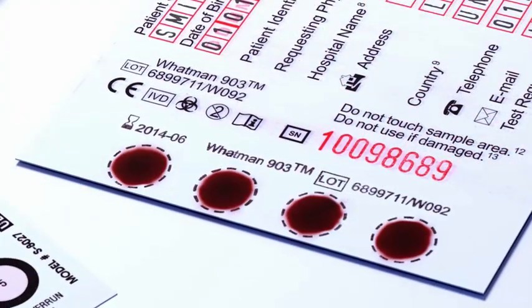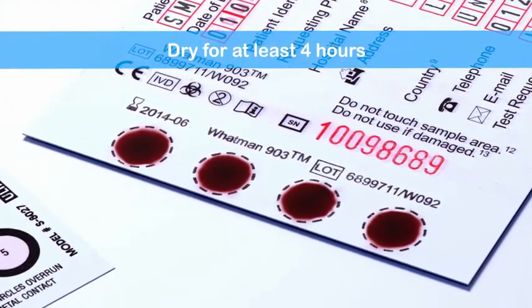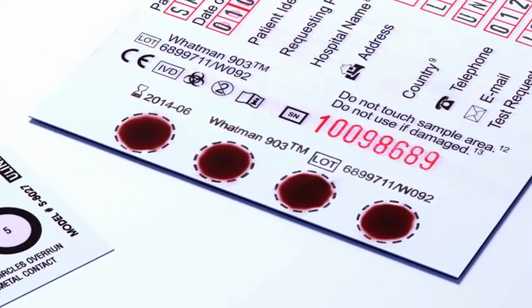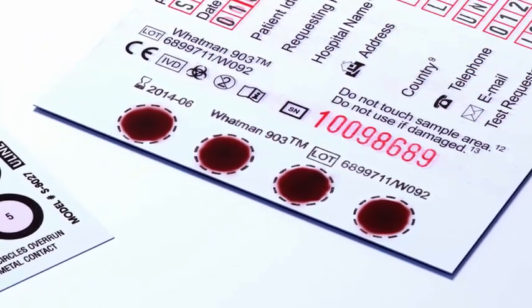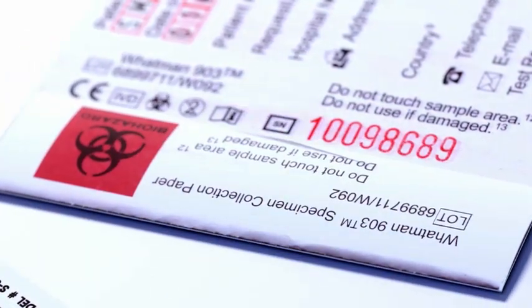To preserve enzyme activity, samples must be dried at room temperature for at least four hours, away from direct heat or sunlight. To avoid cross-contamination, do not stack cards. Cover samples with the attached paper flap after they are dry.